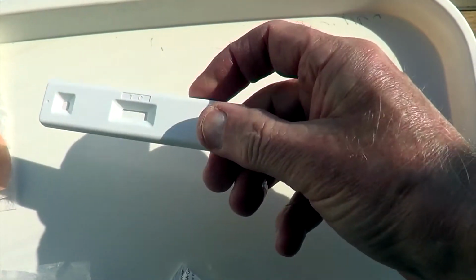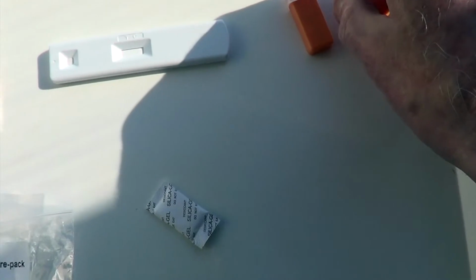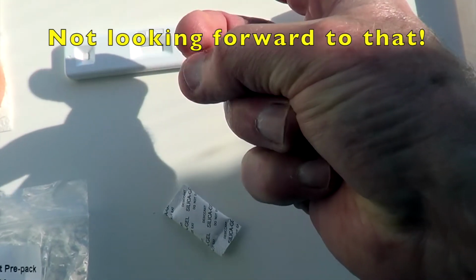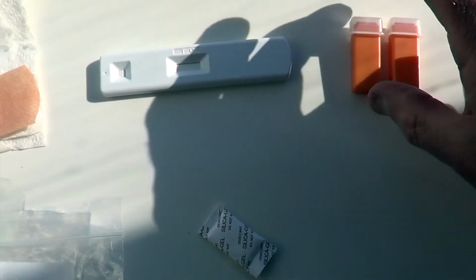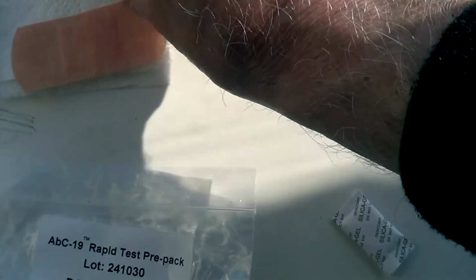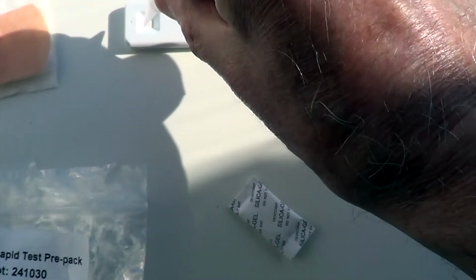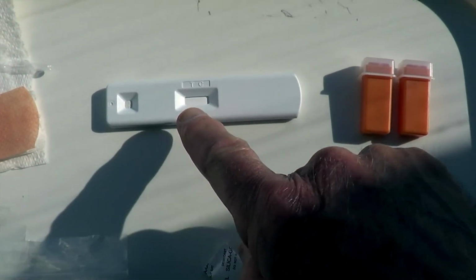Right, so that's the actual tester strip unwrapped, and all I've got to do is use the lancet, take the top off that, press it on my finger towards the edge of the pad of the finger, along here somewhere, or along here, not in the middle, and wait for blood to collect on the surface, draw it up, allow it to draw up to the black line on this, and take this little thing here and push all the blood, squeezing the bulb, push all the blood onto there, into that cavity there, and immediately break the top off this thing and put all the liquid that's in there, which isn't much, maybe that's all it needs, all of it into there as well, and then leave it for 20 minutes until I see a result on here. So, okay, let's get started and have a go at that.